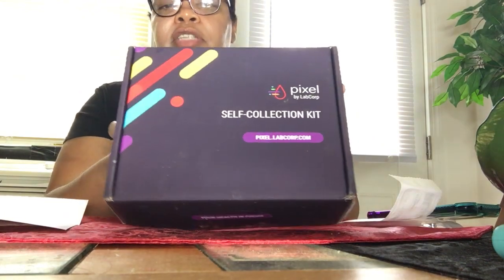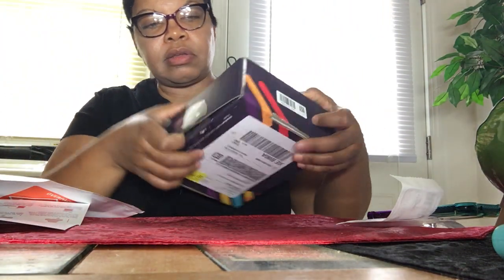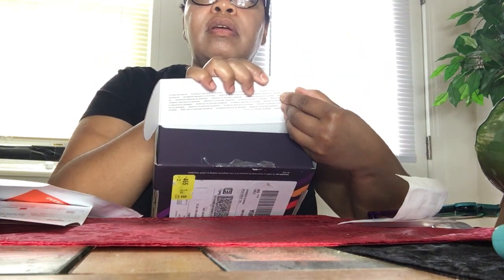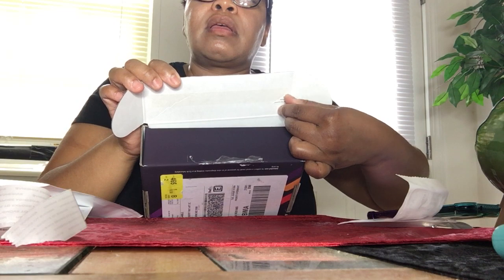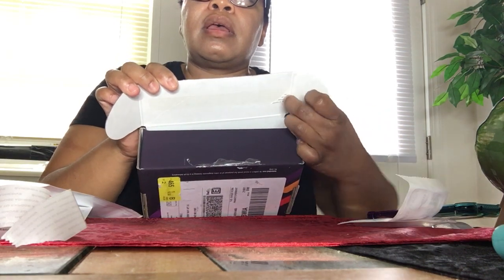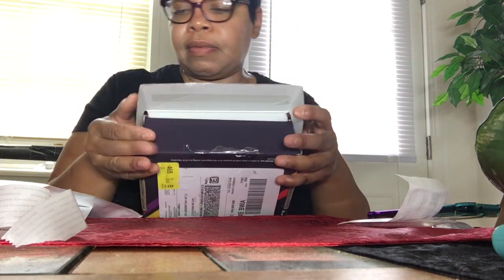I'm glad you can do these yourself — that's good to know. It's Pixel by LabCorp, guys, just in case you're interested. And this is a big huge bag. I found out the Walgreens down the street has a drop-off box.